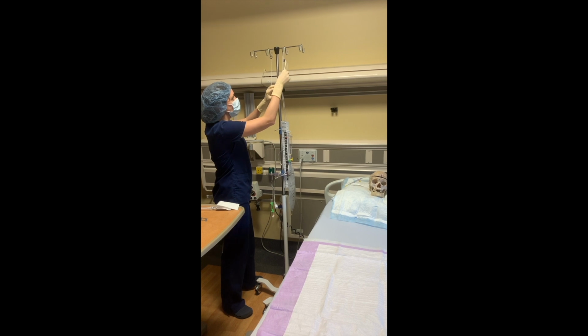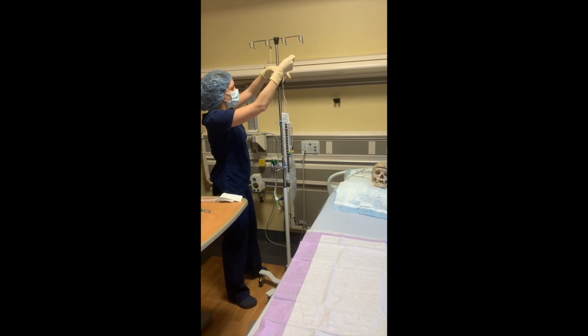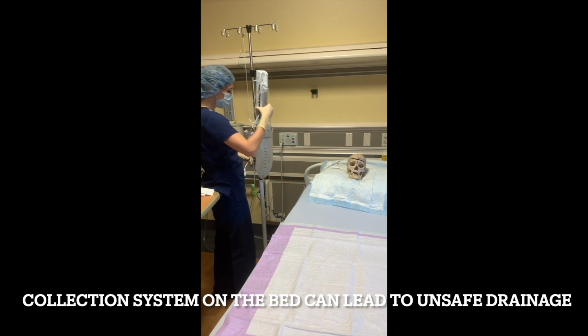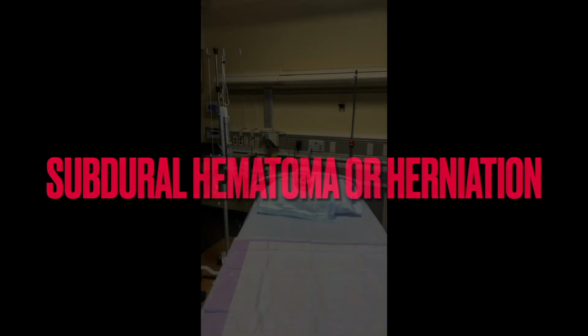Let's look first at the unsafe and improper way to transport a patient with an EVD. The collecting system in this video is removed from the IV pole and placed onto the bed. This can be below the level of the external auditory meatus, leading to siphoning or over drainage of CSF, which can lead to subdural hematomas, herniation, and/or death of the patient.